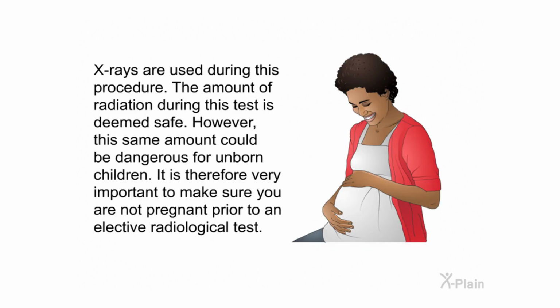X-rays are used during this procedure. The amount of radiation during this test is deemed safe. However, the same amount could be dangerous for unborn children. It is therefore very important to make sure you are not pregnant prior to an elective radiological test.